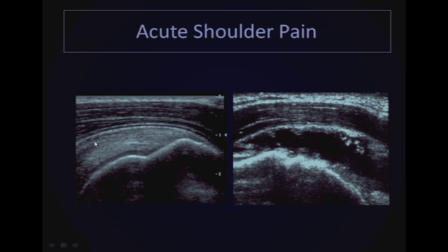And when I look at the rotator cuff, and when I talk to students, this may be oversimplified, but I say that I do layer inventory. There should be 4 layers that you see in a normal image. We have the skin and subcutaneous fat, the overlying deltoid muscle. We have the rotator cuff. In this case, this is the supraspinatus tendon inserting on the greater tuberosity. And here we have the humeral head with a greater tuberosity. There is another layer, which we don't usually see in normal situations, which is the subacromial subdeltoid bursa that sits in this location.